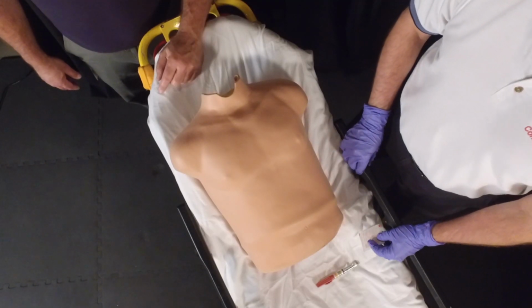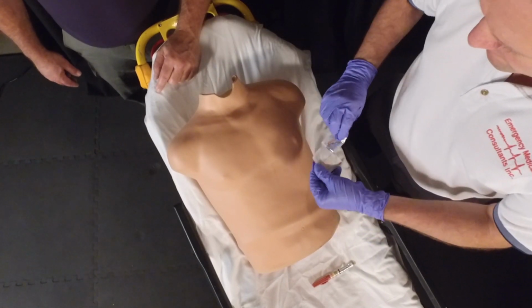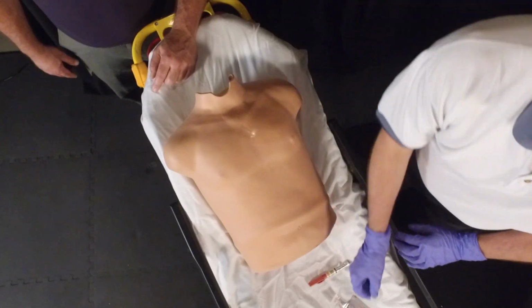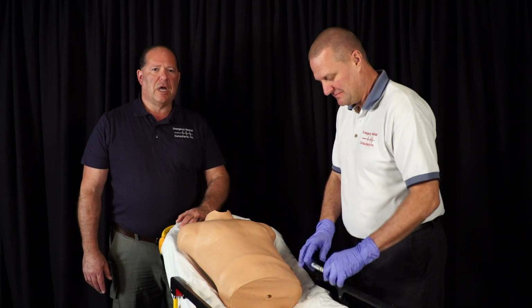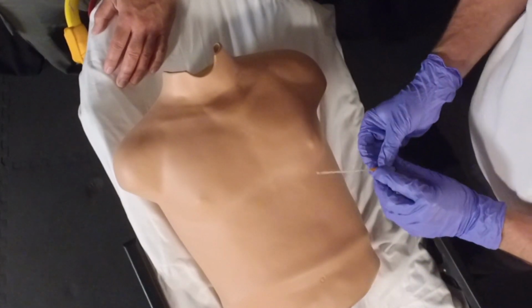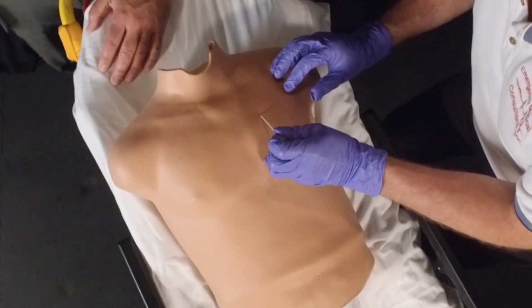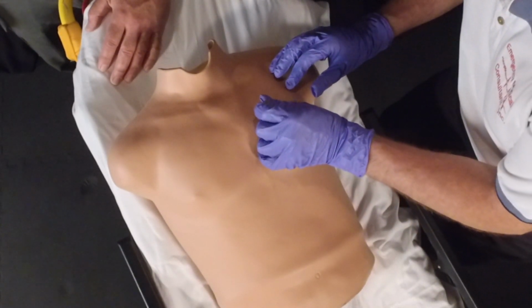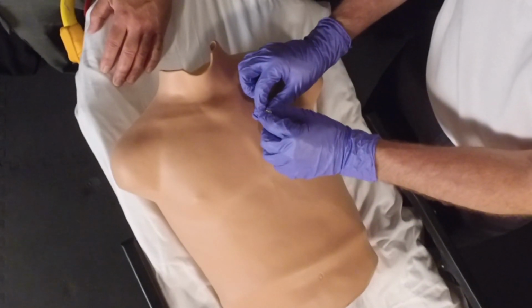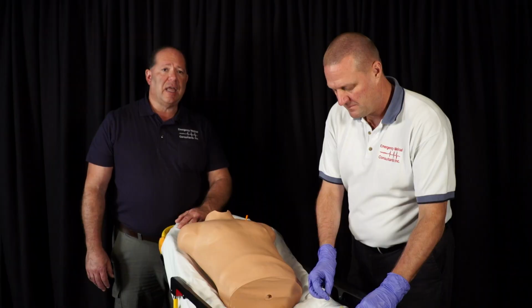So prep the site that you've already found at the second or third mid-clavicular space with the choice that you use, chlorhexidine, betadine, or whatever you use in your system. Once that's done, remember that the needle should be placed over the top of the rib. So find the top of the rib and angle it very slightly over the top of the rib and push it through the pleural cavity. Remember that this needle is going to go in all the way. Once the needle is in, remove the needle, leave the catheter in place, and in reality, that's all you need.